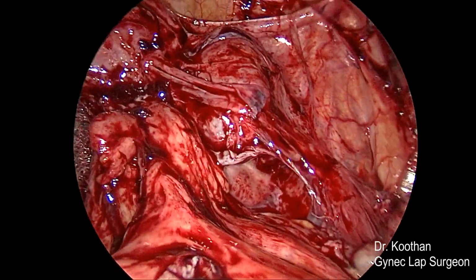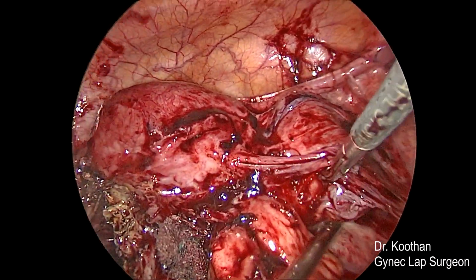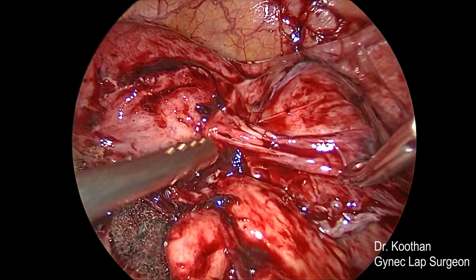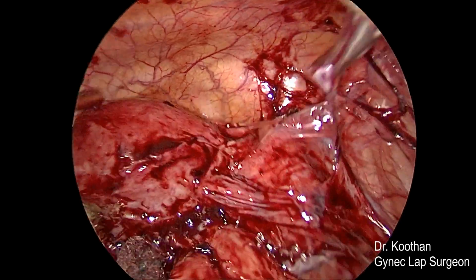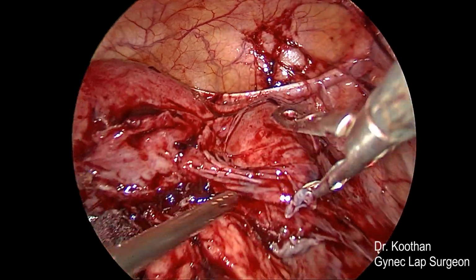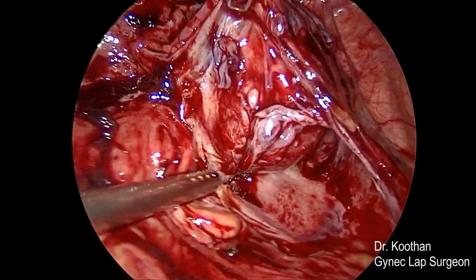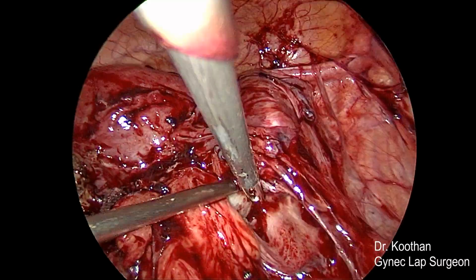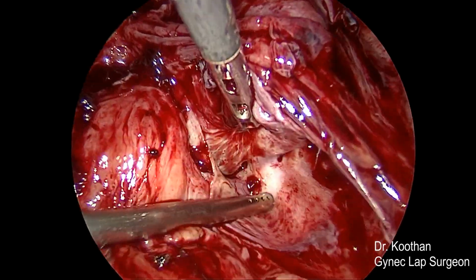As of now, we have only two secondary trocars, one on the left side and one on the suprapubic. No right side trocar has been placed because of the ileal loops adherent over the abdominal wall. Slowly the adhesion is getting released.